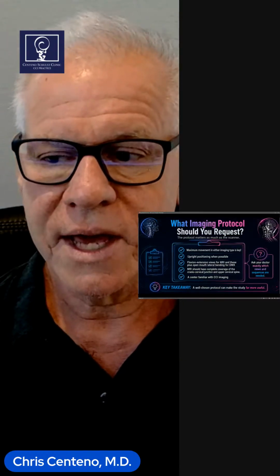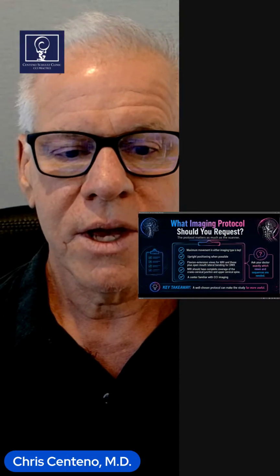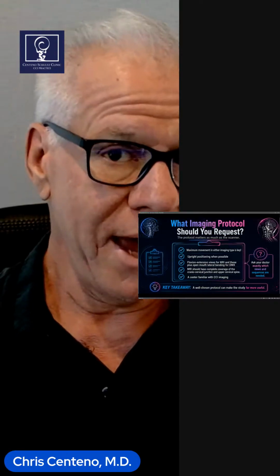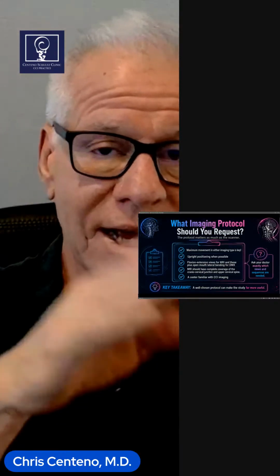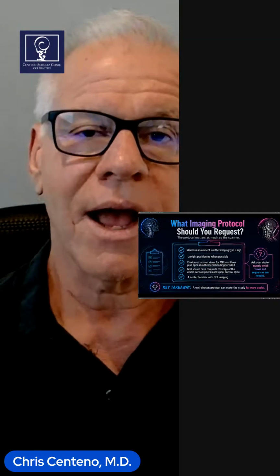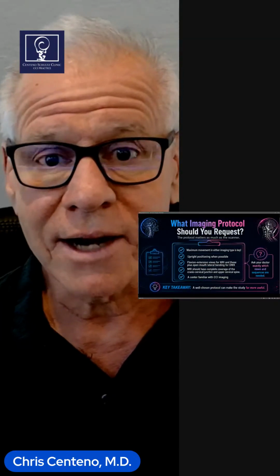Second big rule is upright positioning when possible. You want to make sure the patient is in their natural gravity-bearing environment, right? That's very, very critical. So a DMX fits that. Usually a CBCT, but again, usually has limited flexion and extension. Another thing that fits that would be an upright MRI. Now, compare and contrast that to a lie-face-up-in-a-tube MRI. Now we don't have any natural gravity, right?